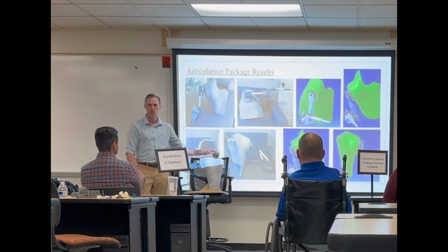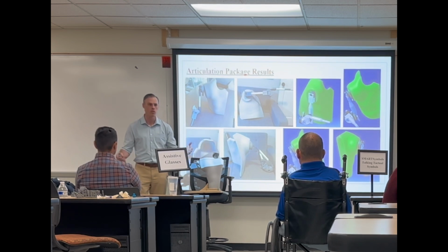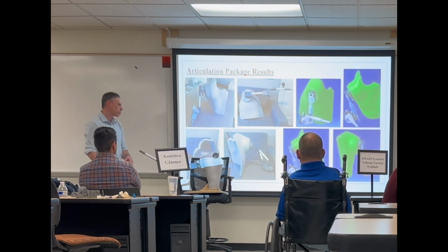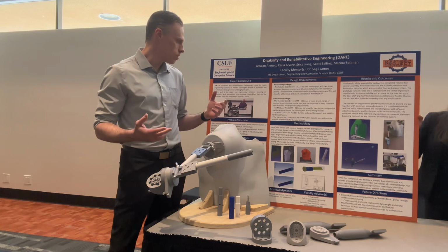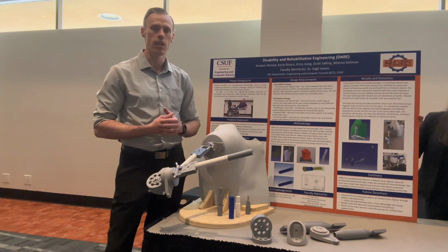the public domain, somebody can print this on their own for a family member or somebody in the field, and not have to worry about some kind of complication. This is all going to be available to anybody that needs it. So that was the goal behind this, making sure that people who need something can access it. So affordability, feasibility, capability, and functionality. The design process here is factored around the patients or the clients that we have to build them for. So we have to consider what their day in a life is.